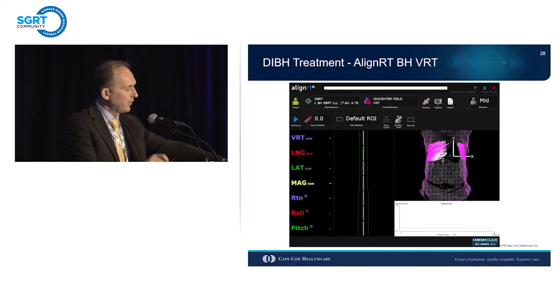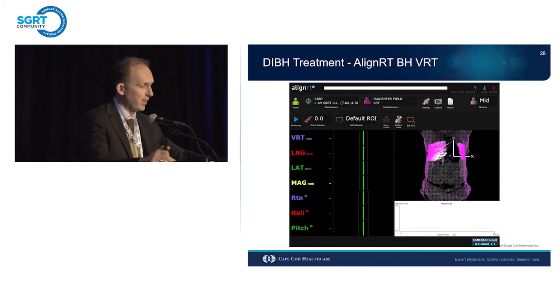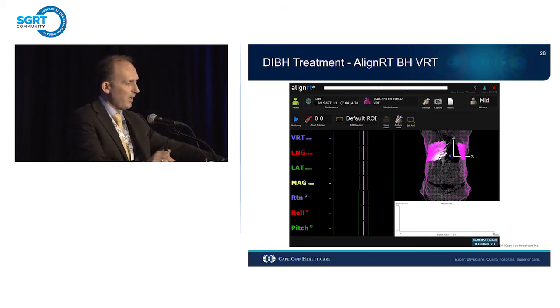So this is something interesting that just recently happened to us, and it is very similar to what we saw in the sim on those images, when the angle of the chest wall is pretty much the same as the mounted camera in the center, and you're losing that surface area right there. Do I have enough ROI for this patient to monitor? Believe it or not, I do. All that stuff to the right or to the left and going down on the side actually worked fine. But I'm missing something that's right above the isocenter. Not ideal.